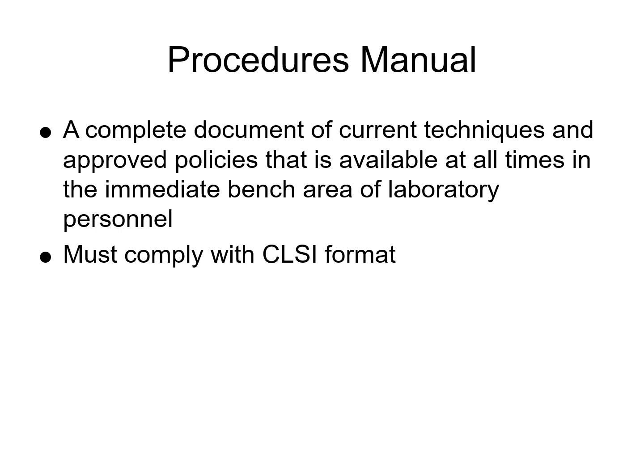Some requirements: we have to have the availability of documentation. So we have to have a complete document that must be accessible at all times at the immediate bench area where laboratory work is performed. This ensures quick reference during testing procedures, minimization of errors, and adherence to approved protocols. The content of the document has to include current serology techniques like ELISA, agglutination, complement fixation, immunofluorescence, and rapid testing.